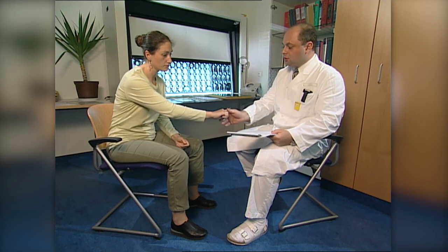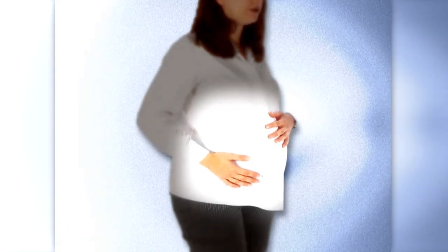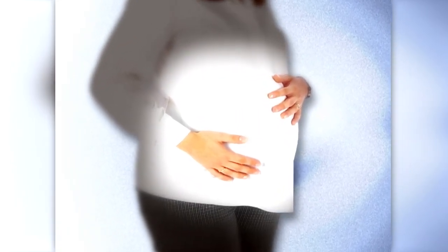The physician cannot make a decision on whether an MR examination should be performed unless the questionnaire has been completely filled out. When examining pregnant women, a physician should clarify whether the indication is valid and whether there is possible danger to the woman or the fetus.